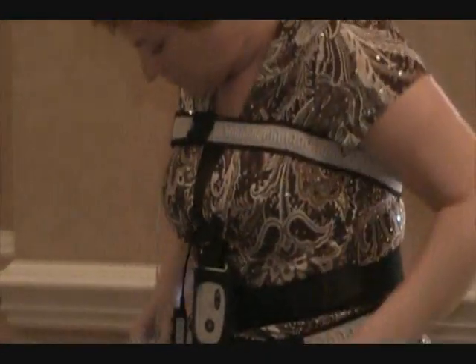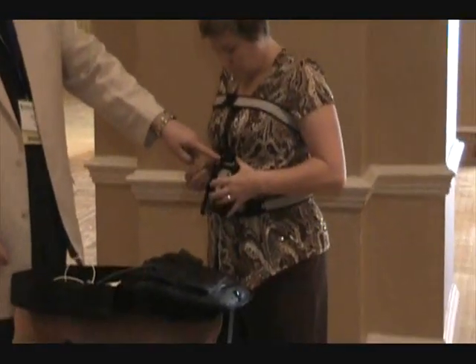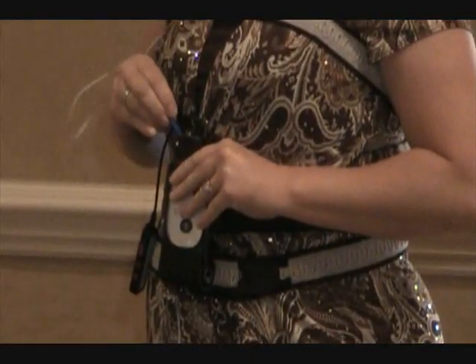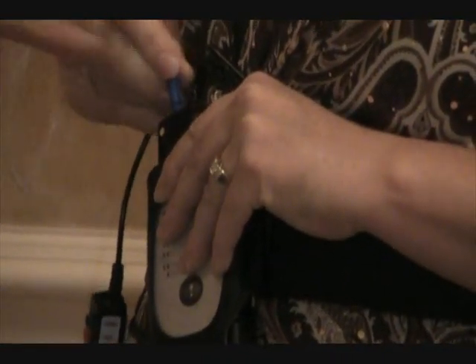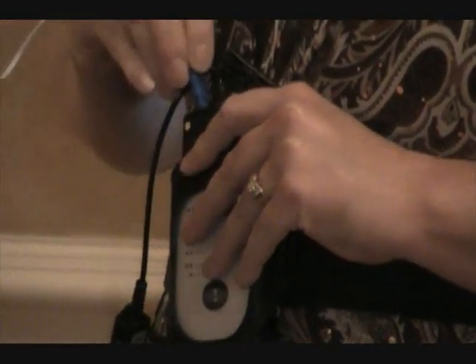The belts are going to go like that. They plug into the color-coded ports — you can see there's a yellow and a blue plug on the front of the proxy. Just plug each one into the appropriate color; they only fit one way. Make sure you push down real firm so it's all the way in. The flat side goes towards the back.